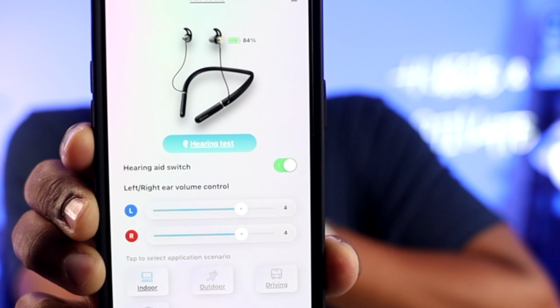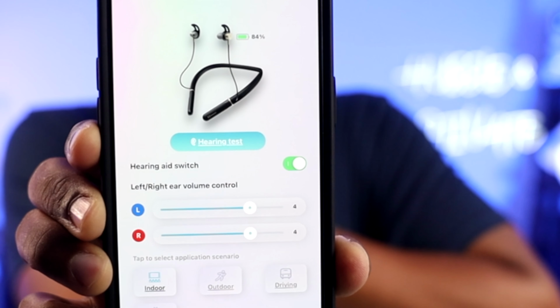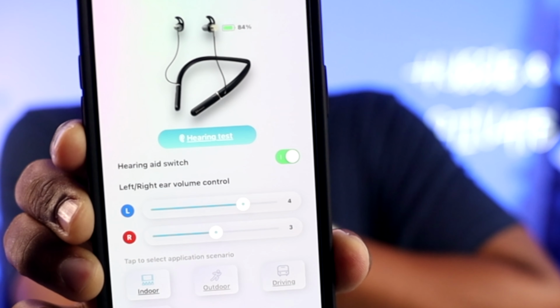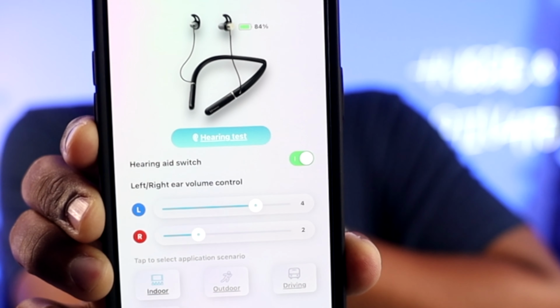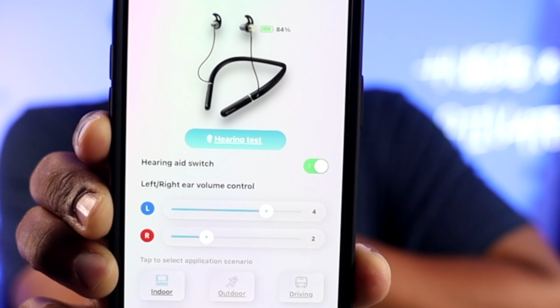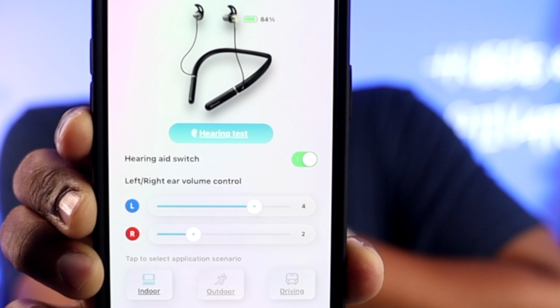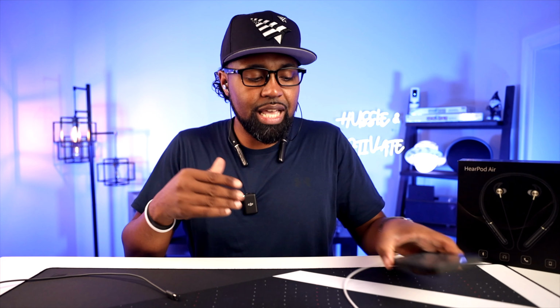You can control these independently. So if I hold down, let's say the right one for 2 seconds, it says right ear. And then if I turn it down, you see that just the right ear is moving by itself. And if I hold down the left one by itself, then you can see that the left one is moving independently. So if you have worse hearing in your right ear as opposed to your left ear, then you can adjust that exactly how you want it.